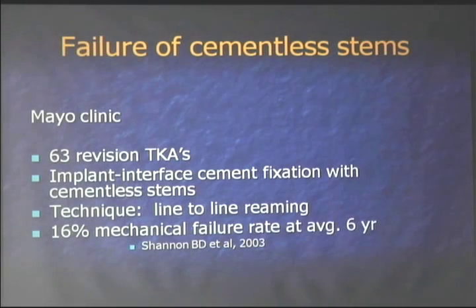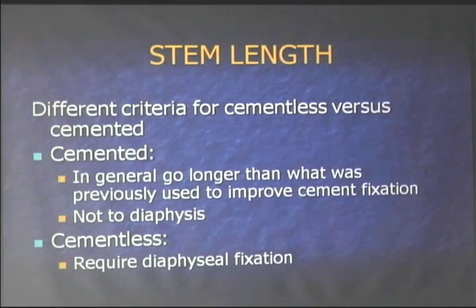The Mayo Clinic really doesn't waver. They favor cemented stems, and it comes from one of their papers: 63 revision total knees using cementless stems, and at six-year follow-up they had nearly a 16% mechanical failure rate. So if you ask Arlen Hanssen, he really doesn't have a strong opinion about anything, but he definitely favors the cemented stem.